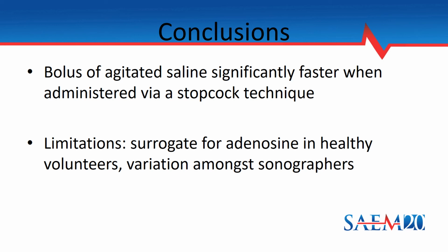Finally, it should be noted that there was variation amongst the sonographers, which suggests a component of subjectivity to the use of ultrasound in confirmation of flush arrival to the heart.